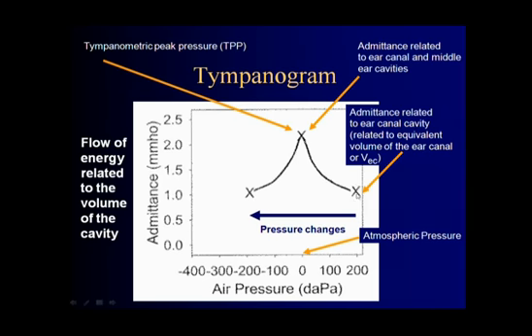So what occurs is the patient has the plug in the ear. There's no pressure put in the ear. They hear this 226 hertz probe tone. All of a sudden, air pressure is forced into the ear canal, and in a healthy ear, the patient will hear this.